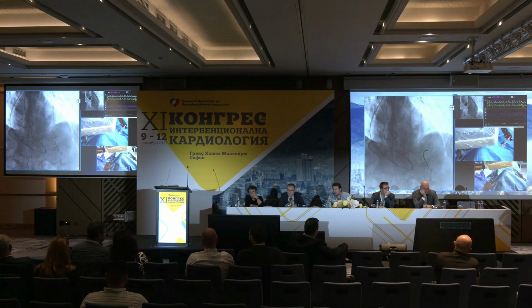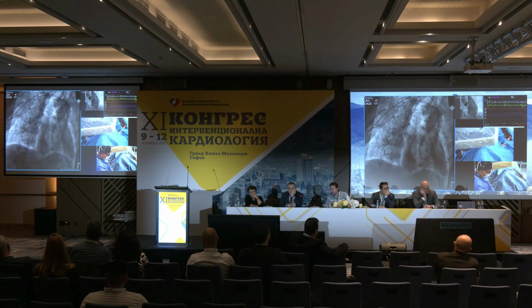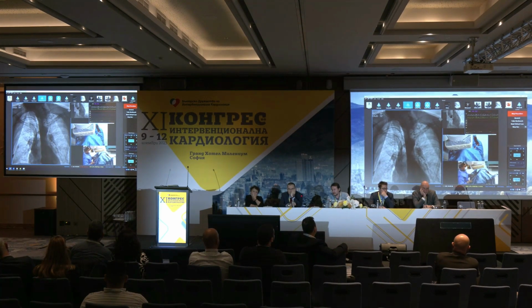And let's go from the beginning of the X-ray. And I will show you also the room. So by the camera, I will show you that the lady is on the opposite side. So we have her head on the right. So her head is here, and over there are the legs, in order to have some commodity for the implantation.